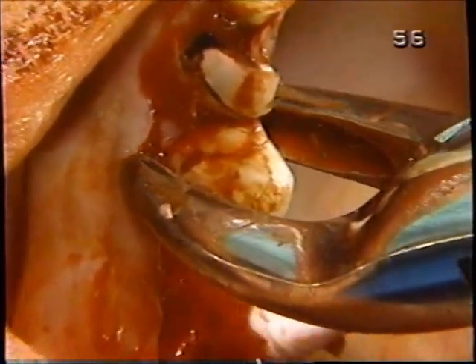Now, this tooth invariably is one of the most difficult. Long axis, some rotation, mostly buccal lingual, patience.